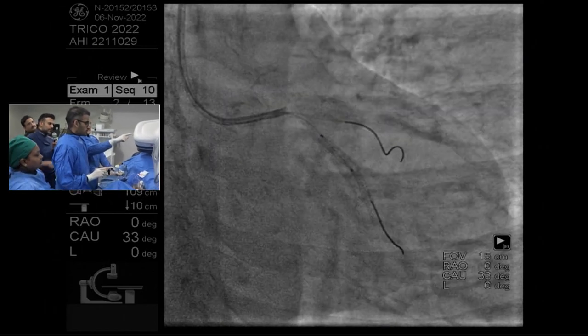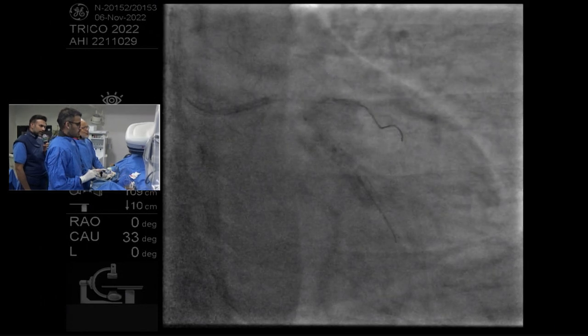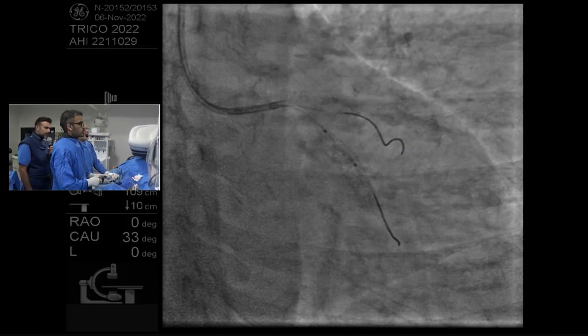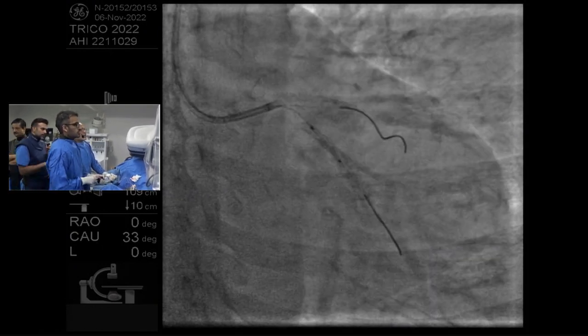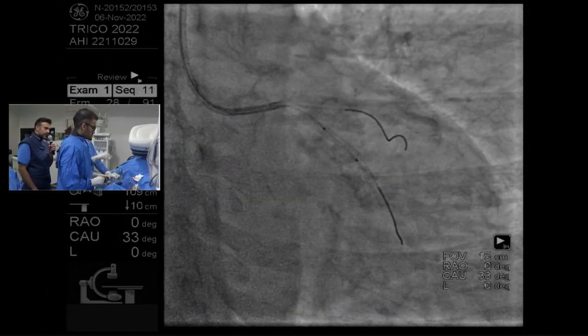Go. Yeah, I would go in with the NC balloon just a hair. Little push. Just a little bit in. There, and just cine that. Okay. And make sure that we're okay there. Yeah. Sam, you can come back. Come Sam back a little there. A little bit too far back. There. Take it. Okay. Sam? Okay. Yeah.